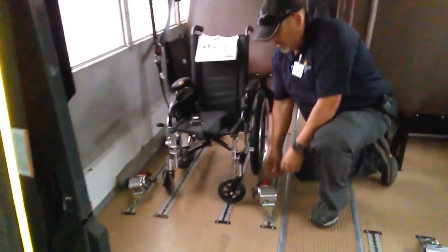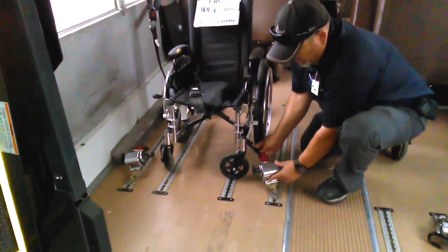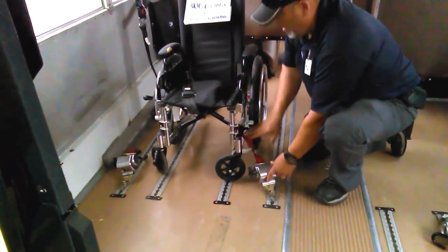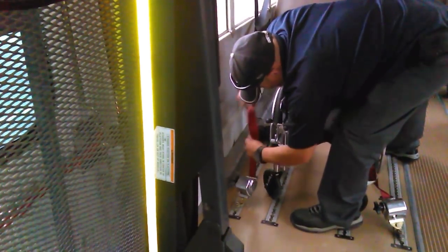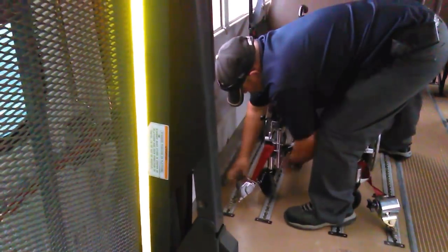Then you have the front retractable hooks. You loosen them up on this side and secure them to the frame of the body of the wheelchair. Same thing on this side — loosen it up and secure it to the frame of the body of the wheelchair.